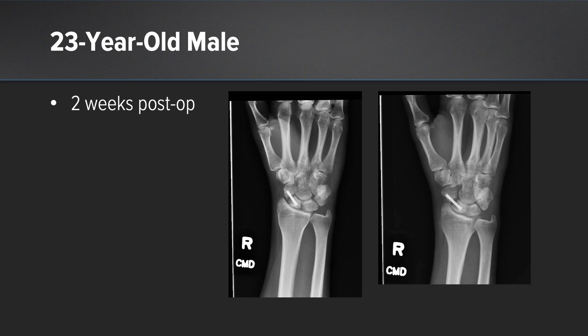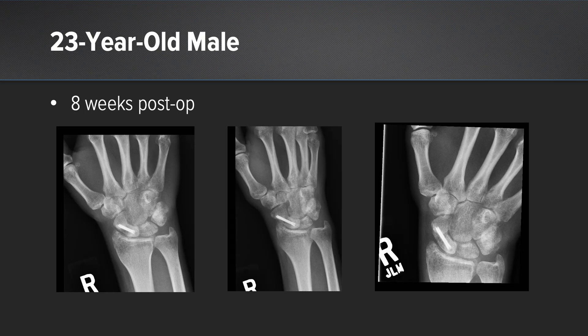These are his X-rays at two weeks post-operatively, where you can easily see the non-union site. Just six weeks later, you can see cortical healing across the ulnar side of the scaphoid.